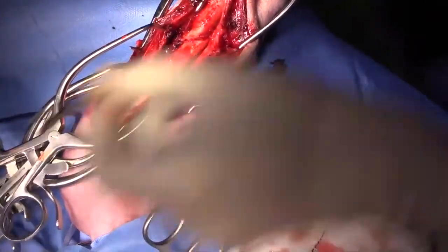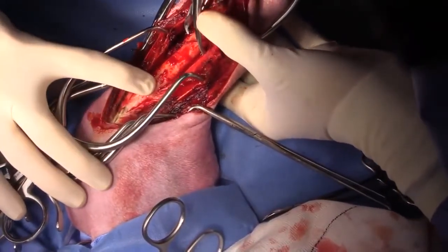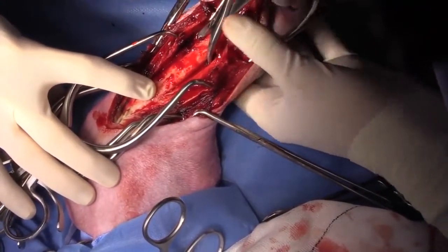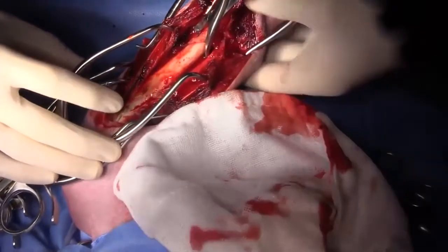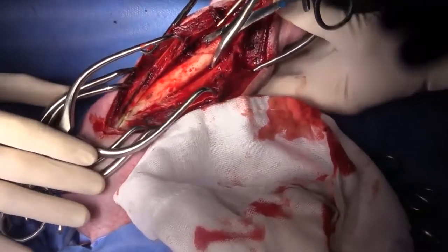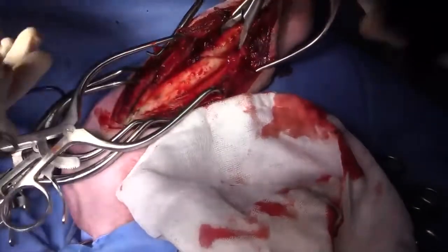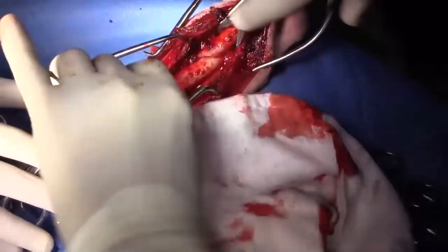That's a really thickened periosteum — probably a couple of millimeters thick at least, rich with osteogenic cells. Some nice big blood clot in the tissues here. So I'm going to see if I can just get a ratcheted reduction forcep. Sometimes you get lucky and it just kind of falls into place.